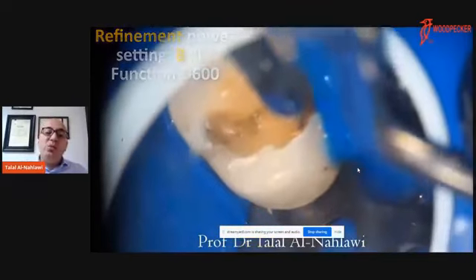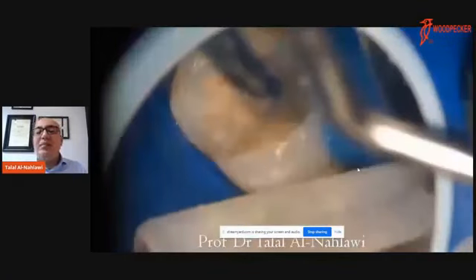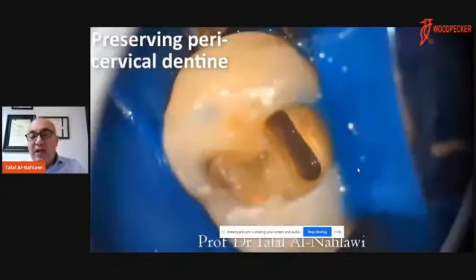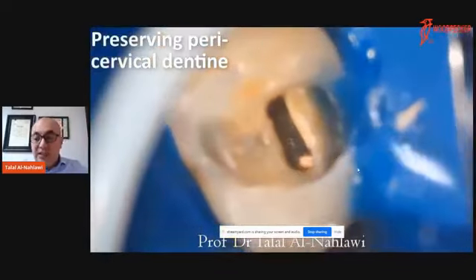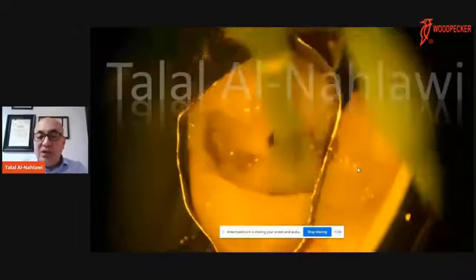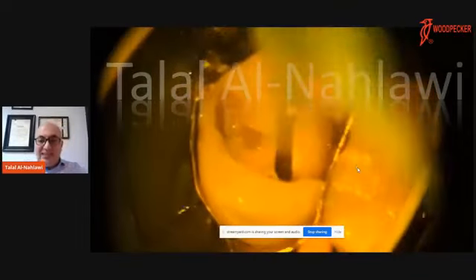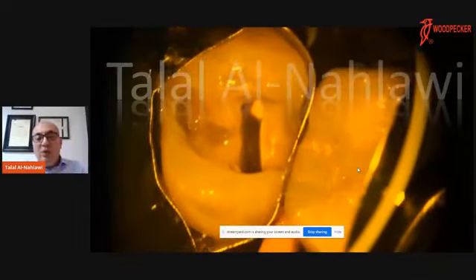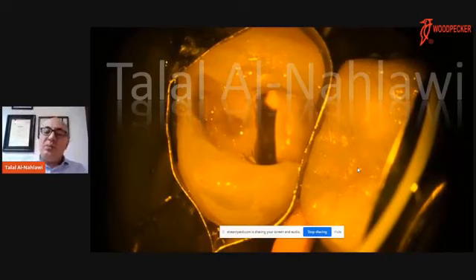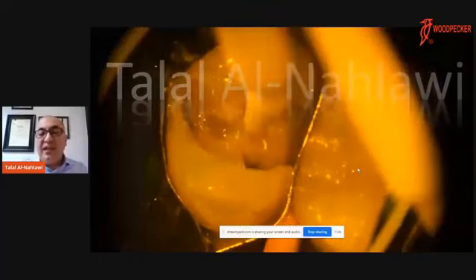I'm trying to smooth the walls of the pulp chamber after complete removal, and I can direct my hand in order to minimize the removal buccally and lingually. And you can see how precise the access cavity was done only using the T3, and it didn't prevent proper instrumentation and obturation. And also you will understand that because the access is preserving tooth structure, we will need to use small brushes in order to insert the bonding agent into the access cavity when I'm performing the final restoration.